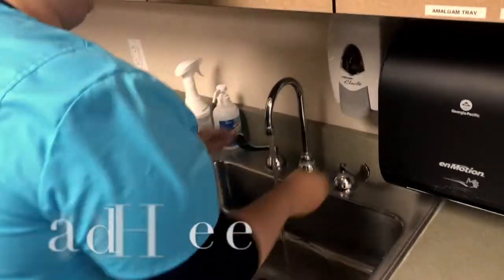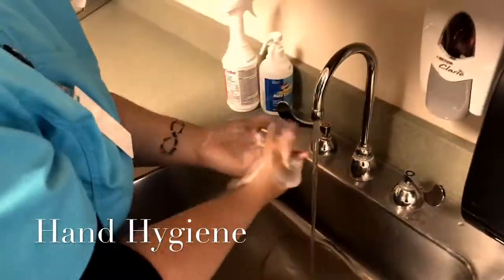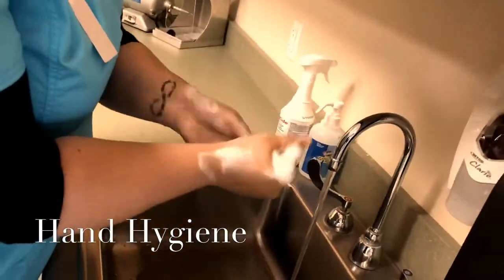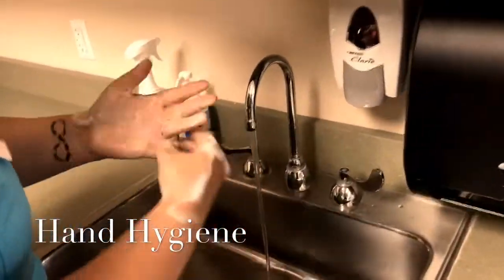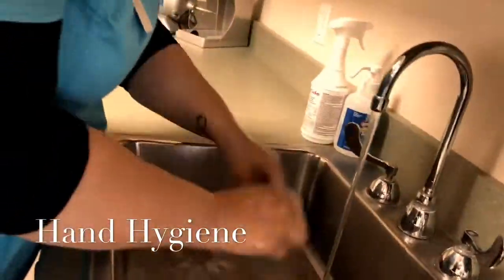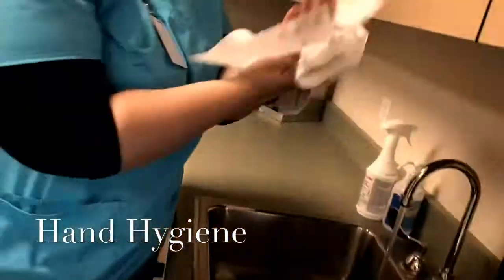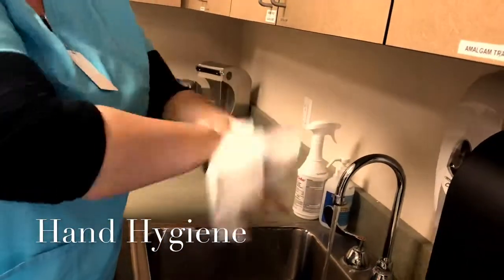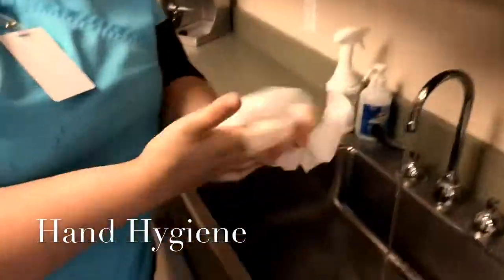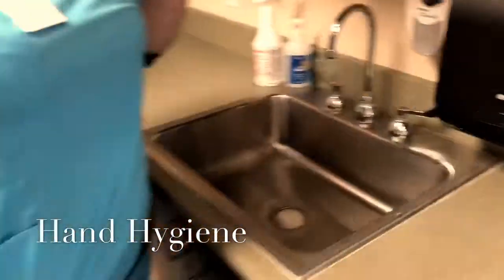So right here we have Samantha starting with our hand washing procedure. She's giving us a great example of how to hand wash in the dental office. You always have to make sure you get your cuticles, between your fingers, under your rings, even up to your wrists. Let the water go down. Make sure you dry your hands thoroughly before you even turn off the water, and always make sure that you don't touch anything at all.